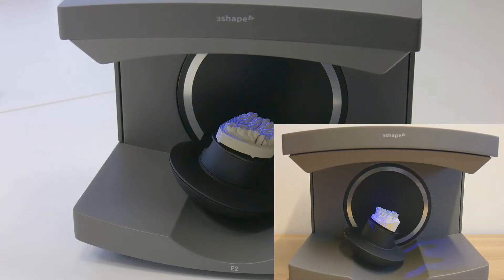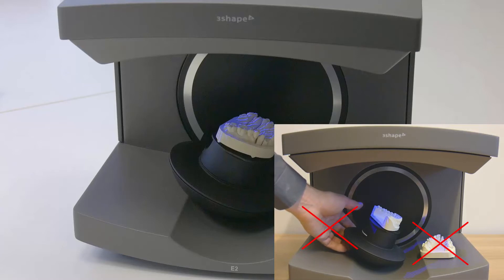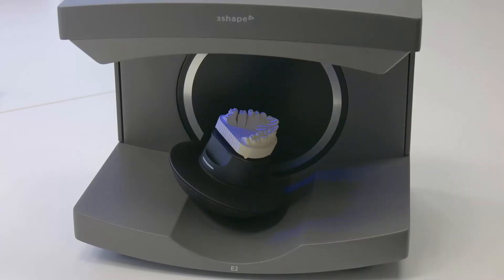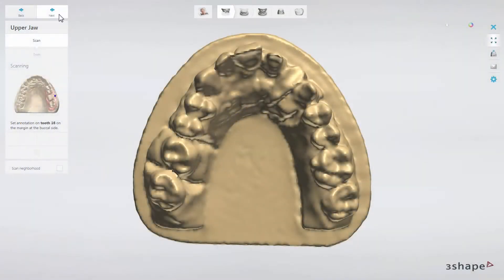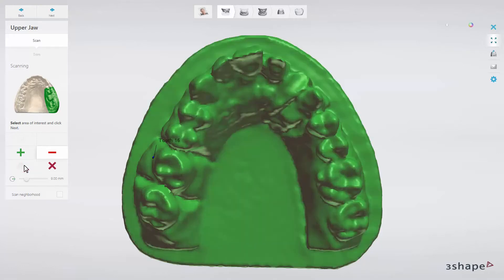To ensure good scan results, do not block or disturb the scanner arm and object during its operation. After a short scanning, the pre-scan model will appear on the screen. You will be prompted to mark the preparation by placing a point on the margin line with the mouse on the buckle side of the tooth. Then you have the option to choose the shape of the scan area. In order to scan the whole model, click the green Select All button. Click Next to proceed.